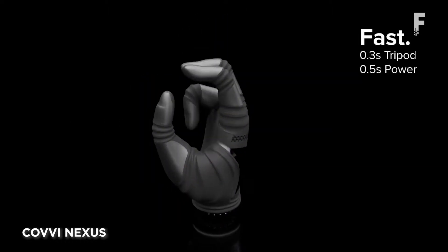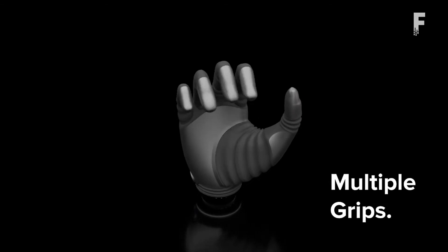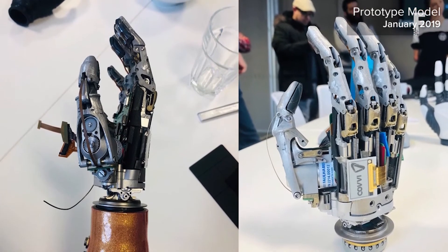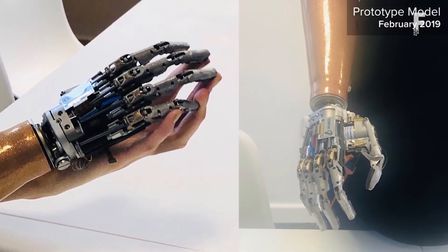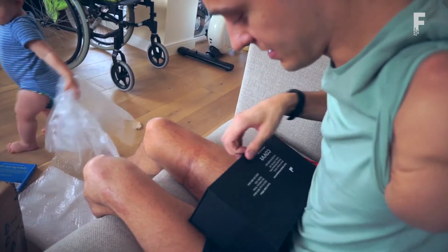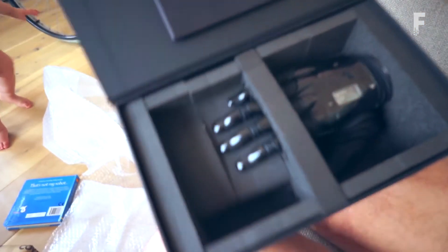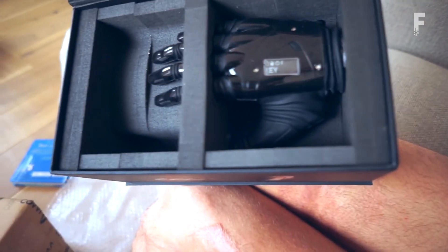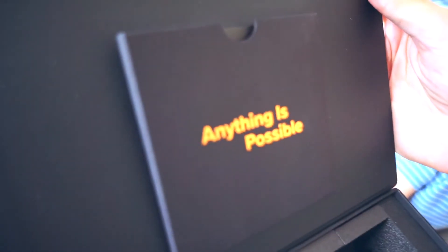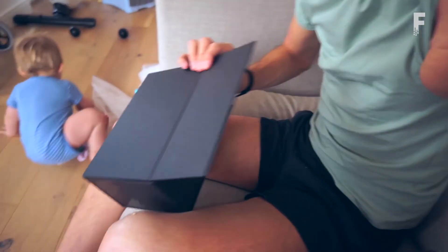COVVI Nexus is a multi-articulated myoelectric hand that brings groundbreaking functionality and accessibility, personalized to each and every user. Built to withstand the strength and speed pressures required of everyday life, the Nexus hand is lightweight and easy to use. The passive full-digit flex capability helps the fingers and thumb move out of danger when they are struck from the back of the hand. The Nexus hand features an innovative actuator design with high power density and comes in three different sizes. The thumb design is fully customizable, operating via thumb force and position sensors in an intuitive rocker switch.